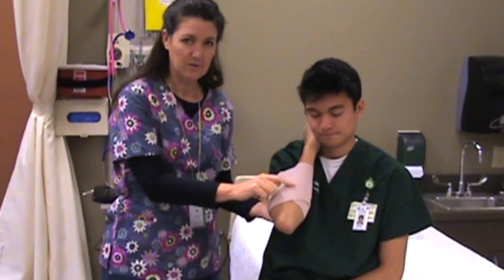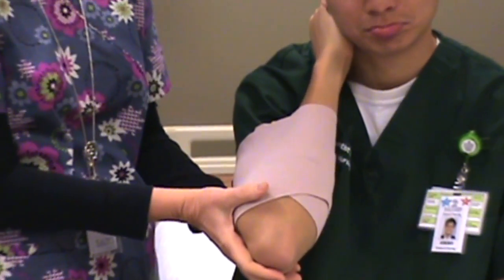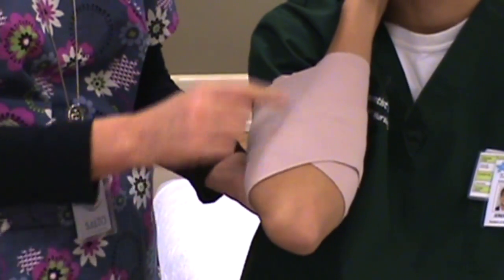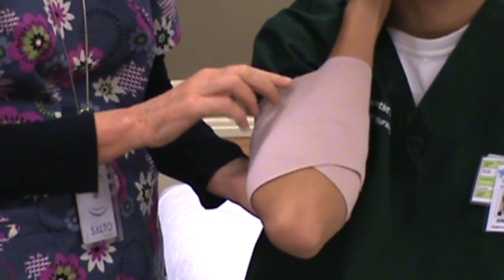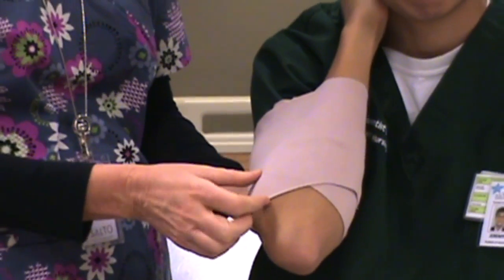and you can look at that and it looks like a reverse spiral here, and if my ace bandage was long enough it would go over the end, which it's not, but that's the part that you want the most wrapped. So you want to start circular up here and then do your reverse spiral going down until you get over the end. And that's wrapping a stump.